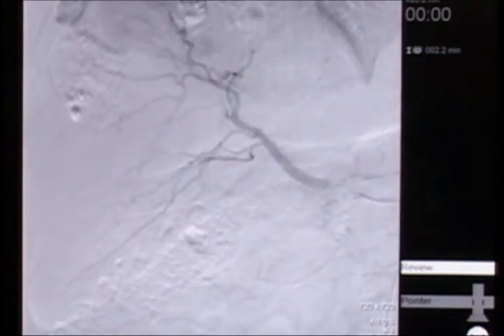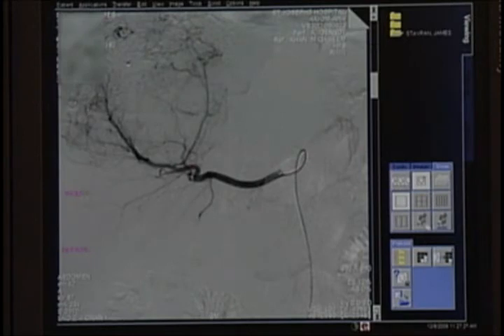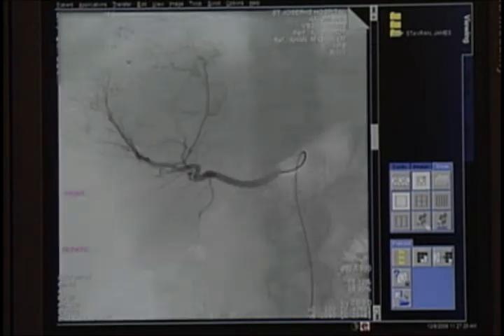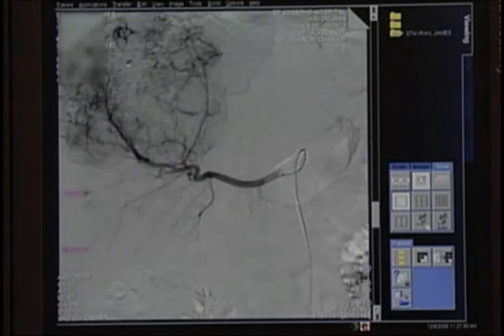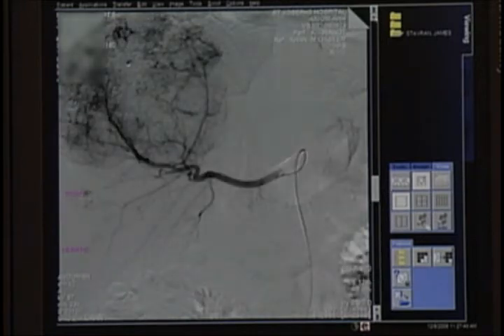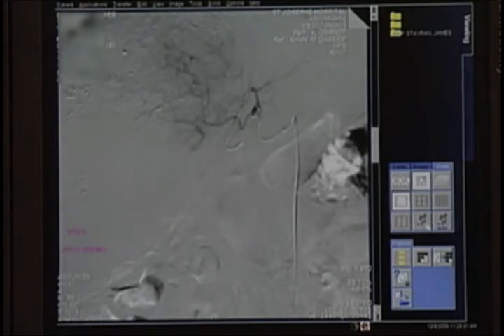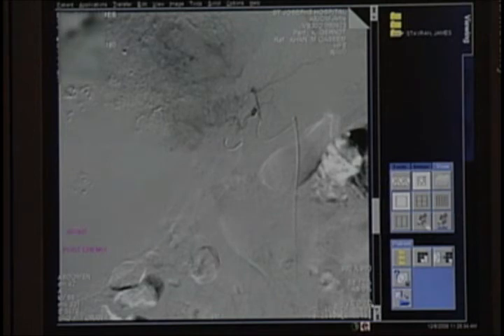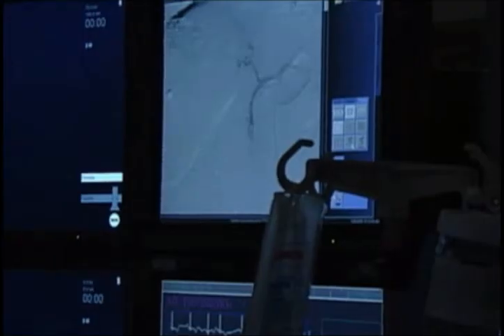The tumor vascularity has changed quite a bit. So this is what it looks like currently — you can see some abnormal vessels in the tumor — but this is what it looked like before we had gotten very many treatments in. There's a lot of tumor blush, all the gray blotchy areas that are showing up. That big round area is all the main tumor mass, and that vascularity has diminished significantly with his previous treatments. He's had five previous treatments to this vessel, and today's treatment will be the fifth treatment to his left hepatic artery, which is the vessel you're seeing now.